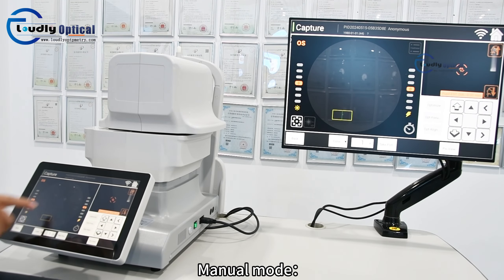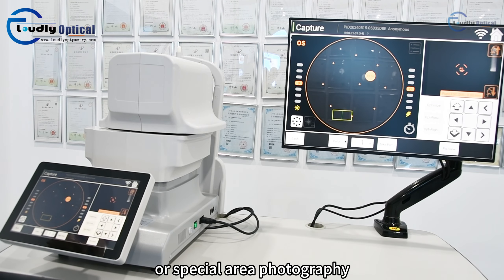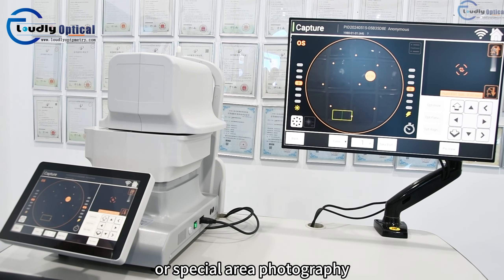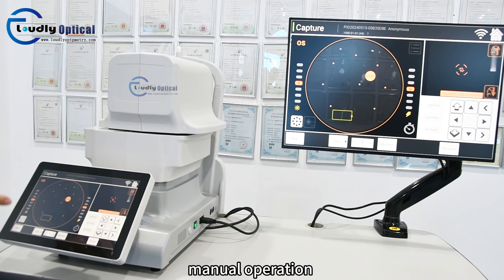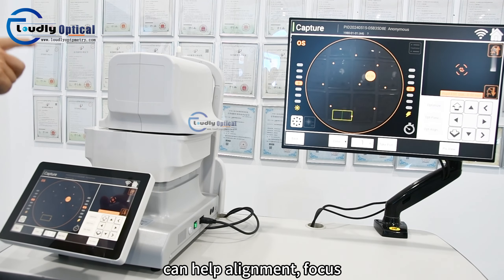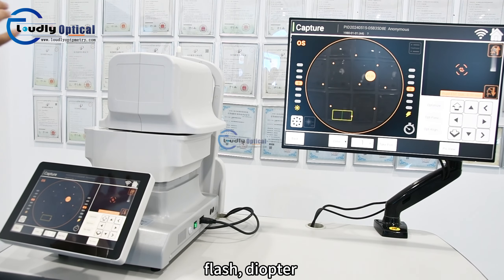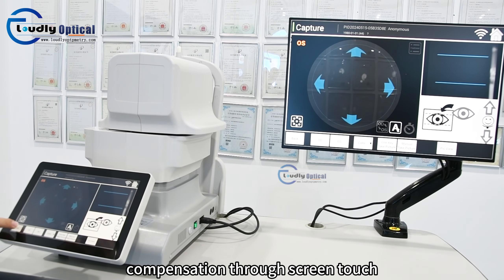Manual Mode: in cases where Auto Mode is not possible, or for special area photography, manual operation can help with alignment, focus, flash, and diopter compensation through screen touch.